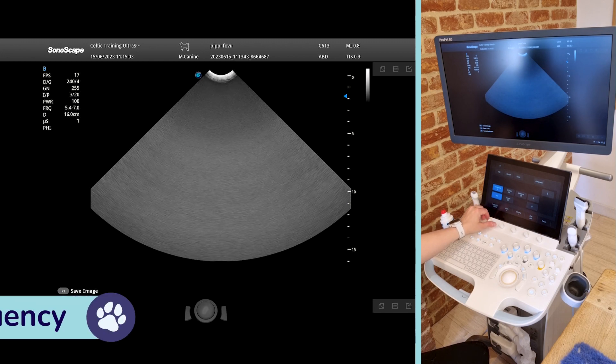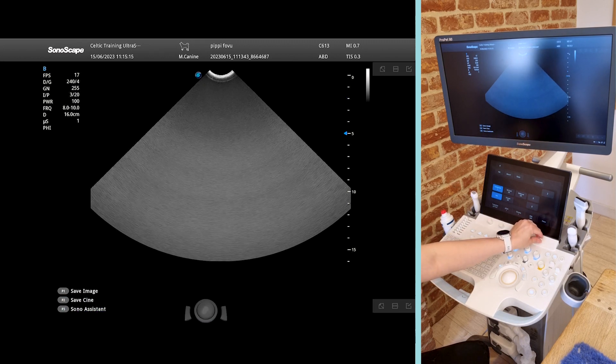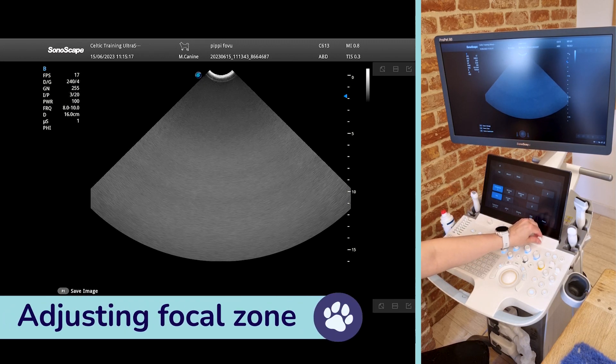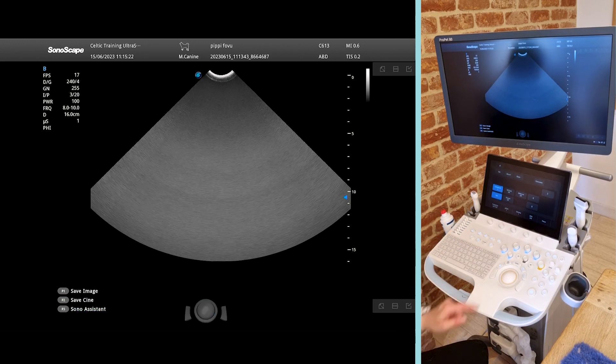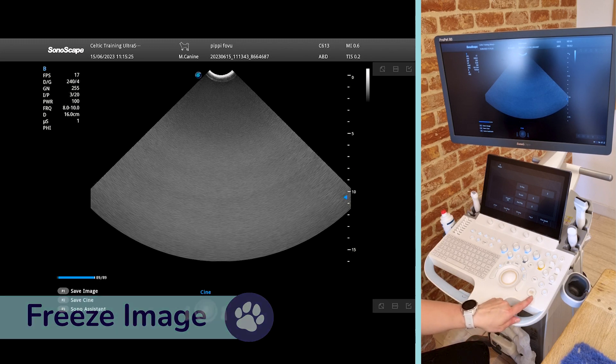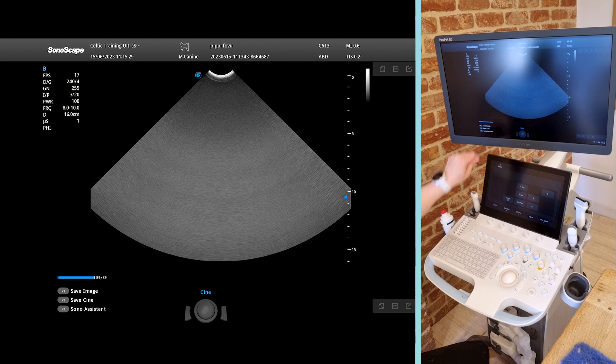You can adjust our frequency — this Microconvex Probe goes from a 5.4 to 7 MHz range right up to an 8 to 10 MHz range. We can also move our focal zone up and down, which you can see as the arrow moving on the side of the image. We've got our freeze button and we can save our images — save image is P1 and save cine is P2.